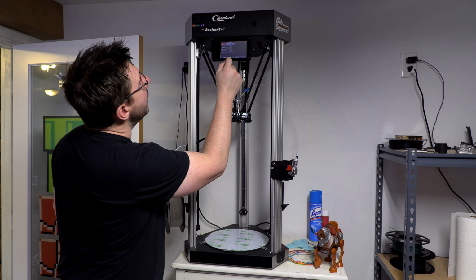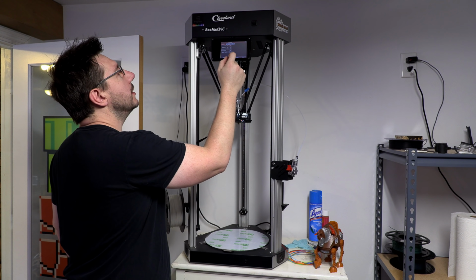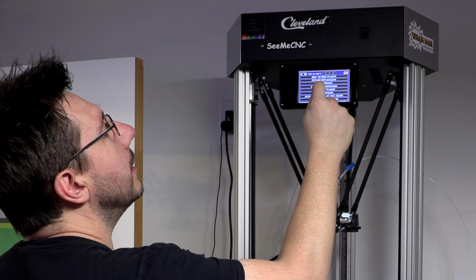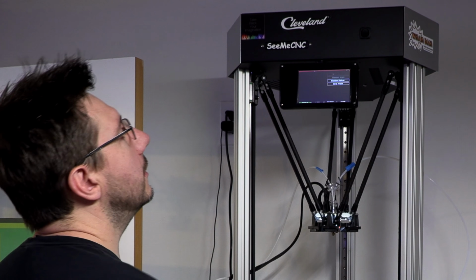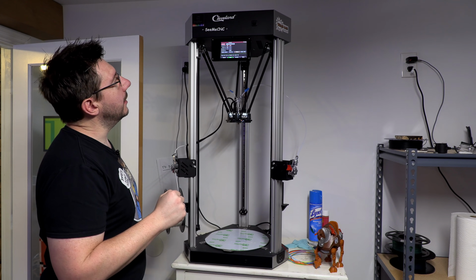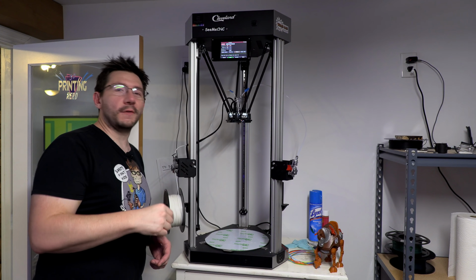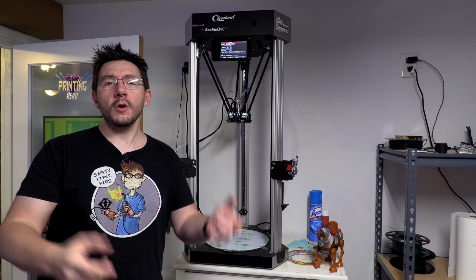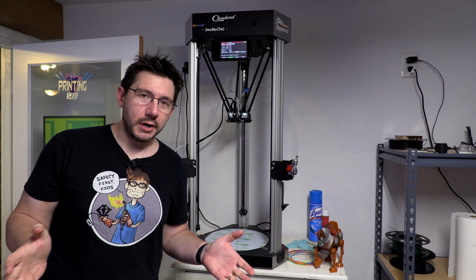And it's Duet, so it's got a little panel up here. I hit control, and then the memory card, and then Manta Ray, and then print. So eventually it'll heat up and print. Now I use Prusa Slicer to slice it for this. Awesome. Okay, these are all set to go. Let's go get those printers in the garage all started up.